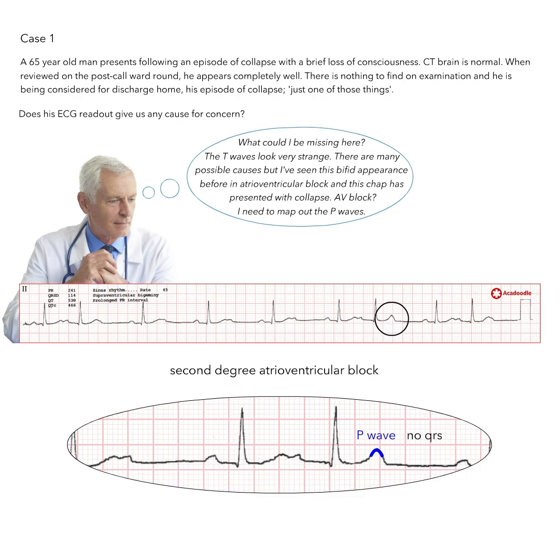This changes our view of the strip. Clearly, in this group, there is progressive PR interval prolongation before a P-wave fails to conduct. This is a case of Mobitz type 1, second-degree AV block.